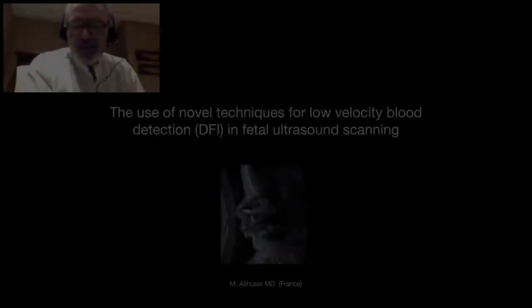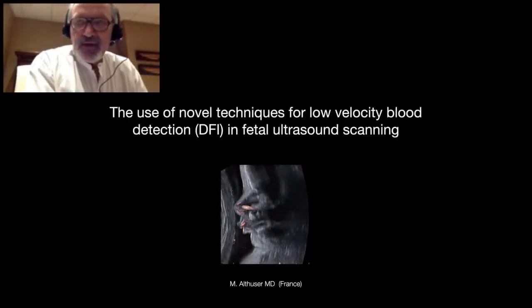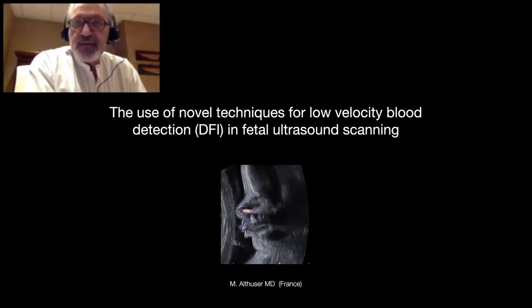Thank you. Thanks, Luca. Good morning, everybody. The aim of my presentation is to show from a few examples the performances of a new imaging technology you heard about, for visualization of the low velocity blood below the previous detection threshold.